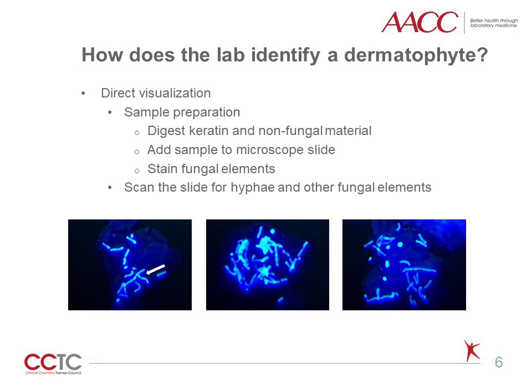Samples must first be processed in order to digest keratinized and proteinaceous material that prevents visualization and staining of fungal elements. This is typically done with potassium hydroxide or KOH, but sodium hydroxide can also be used. Depending on the specimen, this can be done at room temperature or by slightly heating to enhance the digestive process. The time is also variable. For instance, it takes less time to digest skin than nails.